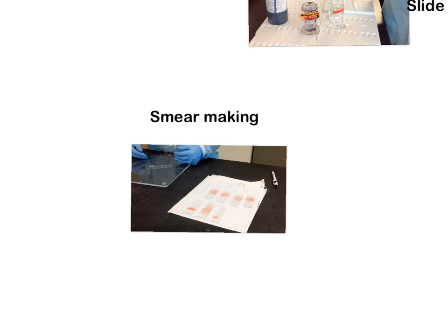So that's the process of how you actually make smears. The other thing I want to teach you is why it's so important to create that feathered edge. When you bring your spreader slide onto your drop of blood, you are waiting until you can visually see the drop spreading out on both sides of your spreader slide.